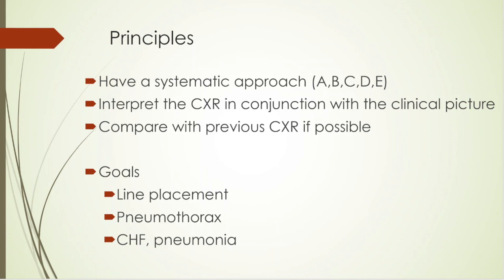So some of the goals of this podcast, especially for ER people and anesthesia people: line placement, obviously verifying any central lines that you put in, making sure that you don't have a pneumothorax either from the central lines or if you get a trauma in or whatever, and picking up congestive heart failures, pneumonias, and things like that.